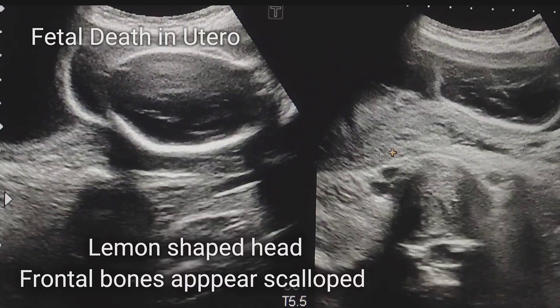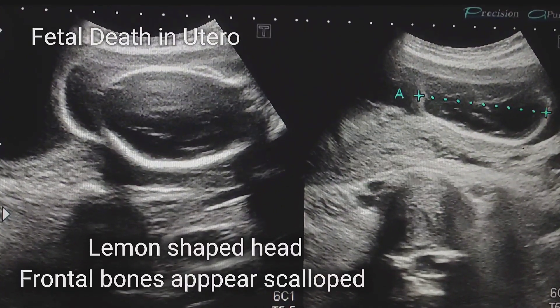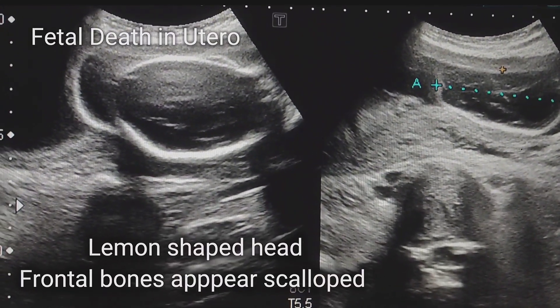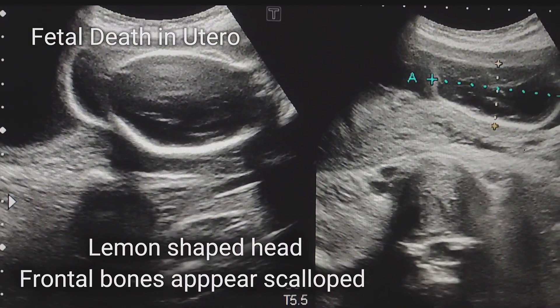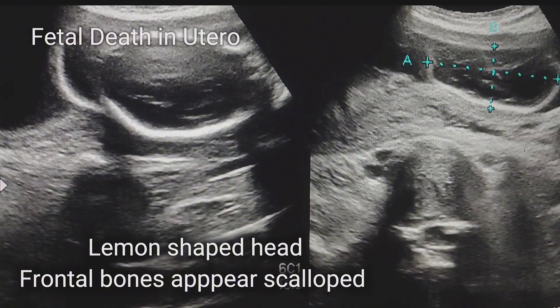The frontal bones or skull appear scalloped, giving a lemon-shaped appearance to the head of the fetus.